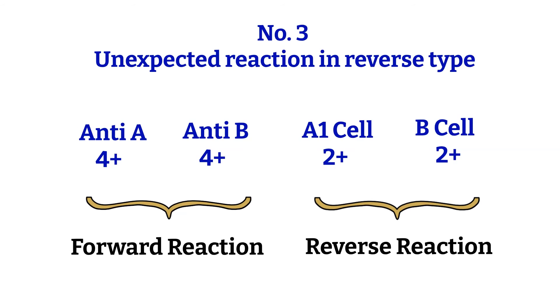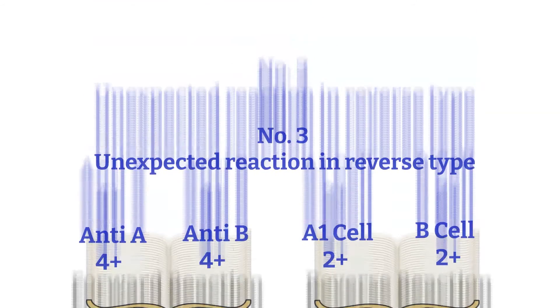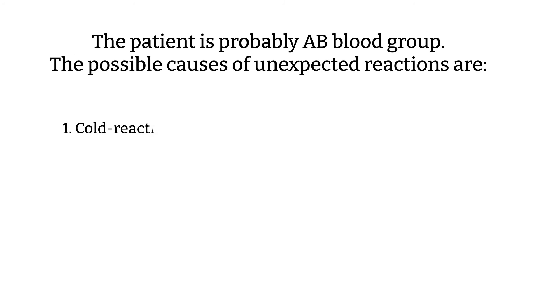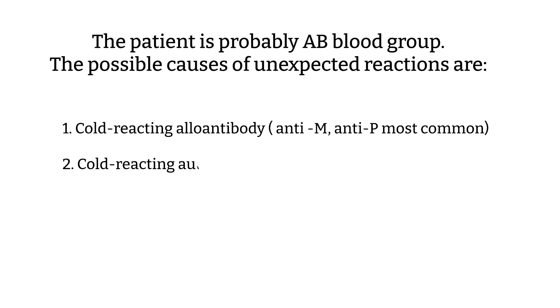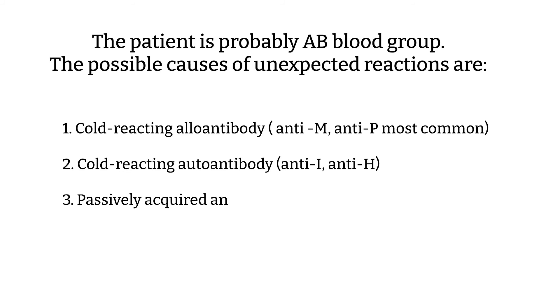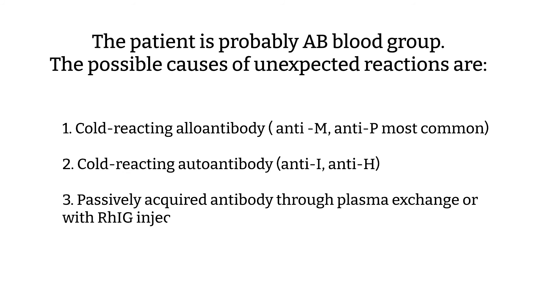This patient is probably group AB blood type with the following possibilities: 1. A cold-reacting alloantibody such as anti-M or anti-P, which is more common. 2. A cold-reacting autoantibody such as anti-I or anti-H. 3. Passively acquired antibody through plasma exchange or with RhIG injections. Or 4. It could also be Rouleaux.